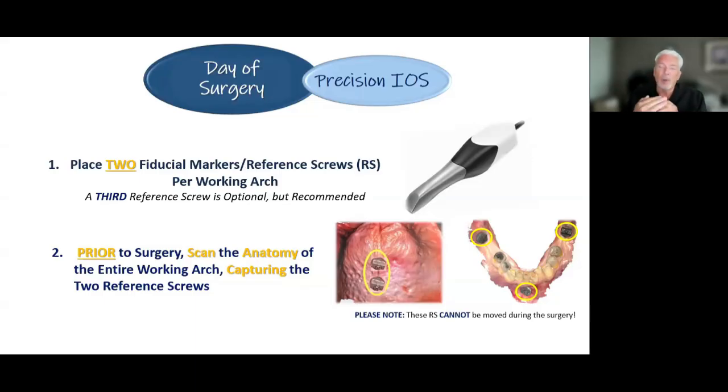We like to see two, spread apart. I like to see about 8 to 10 millimeters of space. Your scanner needs to capture the distal side of these as well. The more information you can capture, it's like getting a margin on your impression. You get a very accurate impression of your crown prep margin, and the lab can make you a beautiful fitting crown. Same here. You get a good, accurate scan of these reference marks, all the scan bodies, these markers.